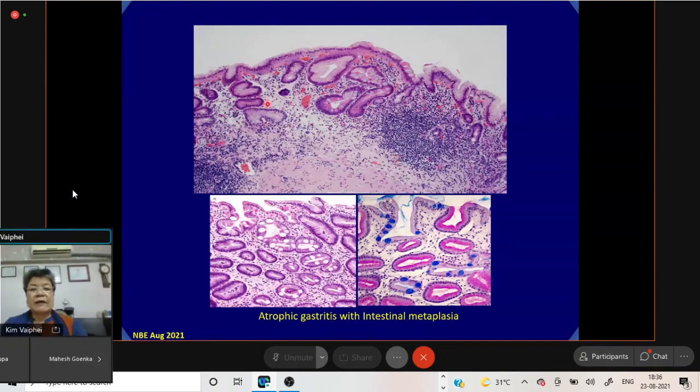And now coming to the chronic gastritis changes here, this is the mucosa is thinned out. It can be from any site. It could be fundus, body, or it could be from pyloric antrum. Without the site being mentioned, it is not possible from the atrophic changes to say from where this mucosa biopsy could have been taken.